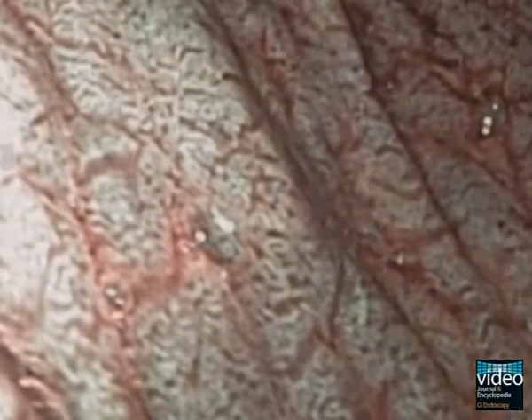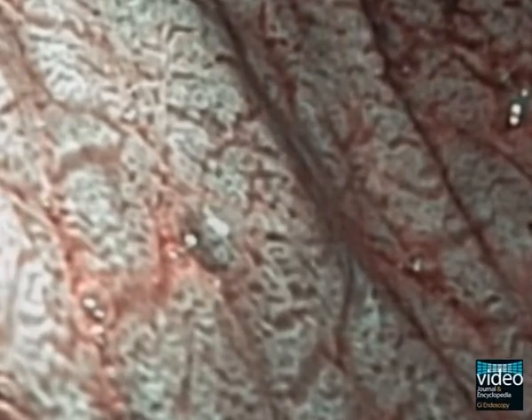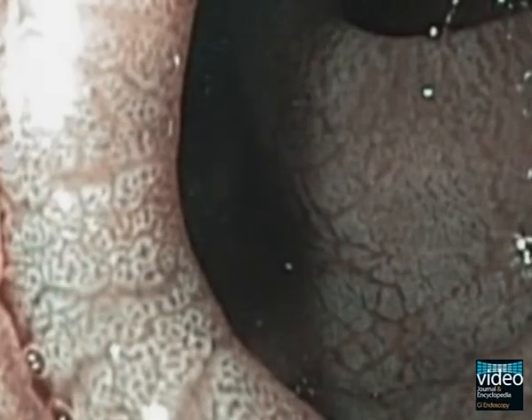Capsule endoscopy findings resemble high-resolution upper GI tract video endoscopy. Mosaic pattern of the mucosa and scalloping of the circular folds is well demarcated and might even be better visualized with use of optical enhancement techniques such as narrowband imaging.